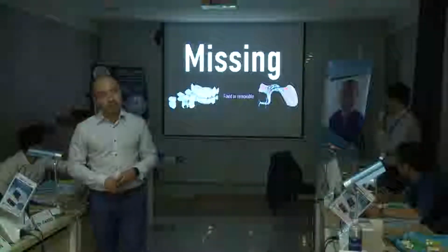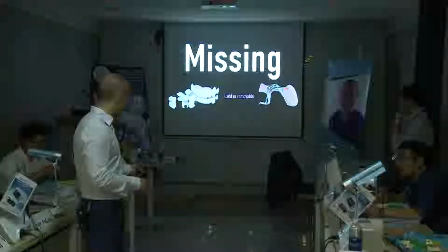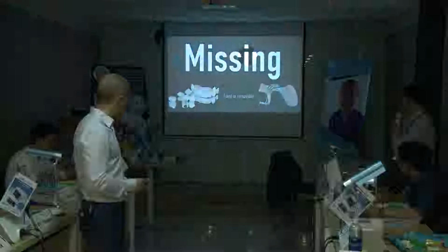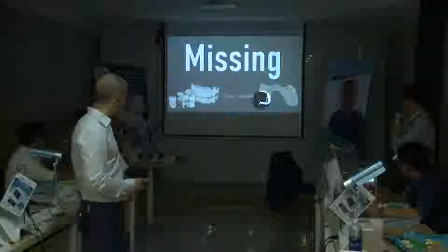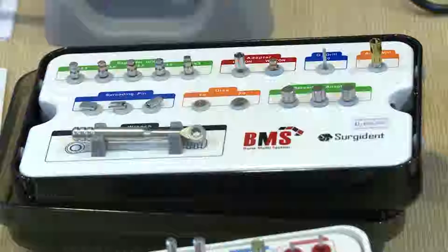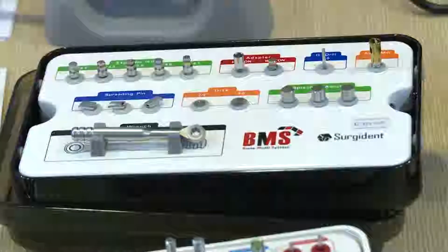So this is the question I always ask my patients, because removable I can also use with implants. For example, when the patient wants a removable denture and she doesn't want to have the retention frame in the anterior part, I can place 2 implants in the anterior and she can fixate her removable on there.